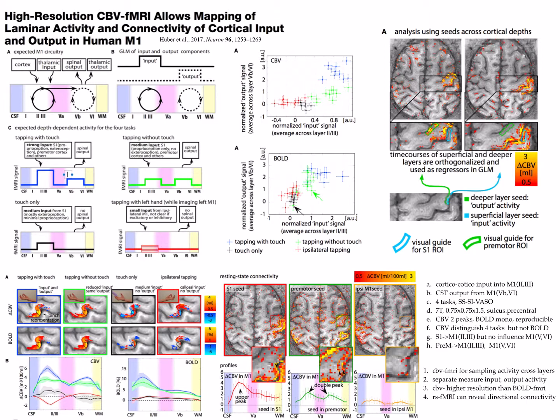In this sequence, he can saturate the blood signal from the whole slab, and using the inversion technique, only make the magnetization in the imaging slice steady state, so the signal in that slice is high. When you assume that both the blood and the tissue have the same T2-star decay, then you can calculate the CBV.